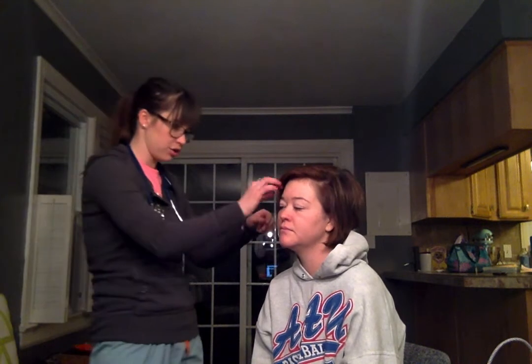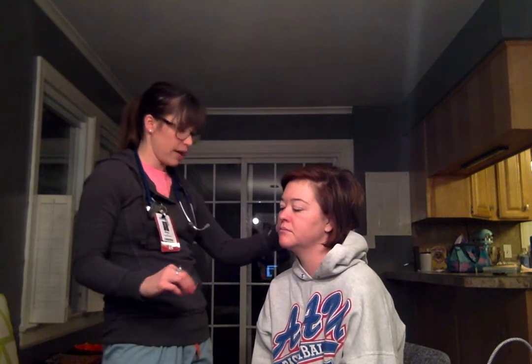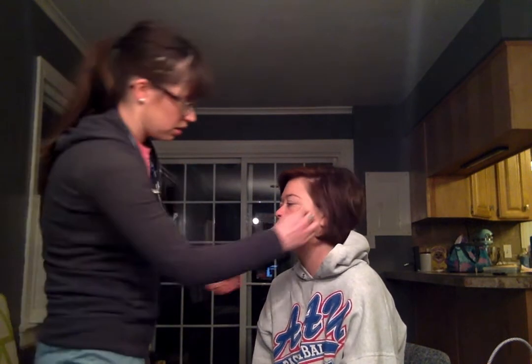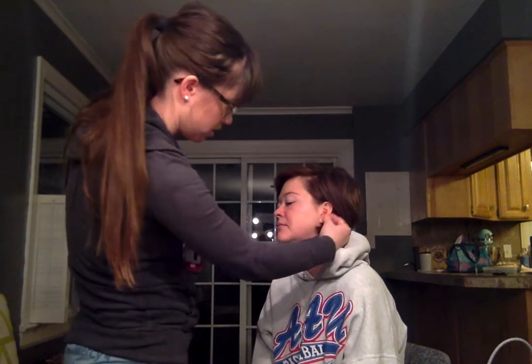So first I'm going to inspect her external ear to see if there's any lesions or drainage. Her right ear does not appear to have any crusting or drainage coming from it. Check her left ear. Whenever I pull on your ear, does that hurt at all? No. So I checked that to see if she had any problems with the ear infection before I actually shined the otoscope into her ear, and it did not hurt. So I'm going to go ahead and assess the internal ear. So I'm going to pull your ear up and back and look in your ear.